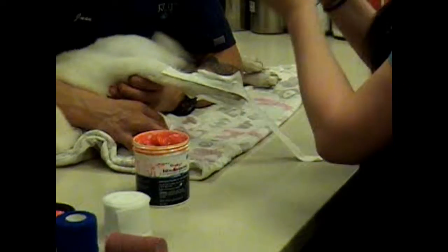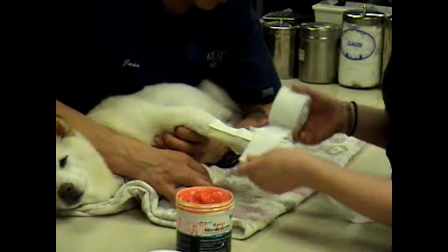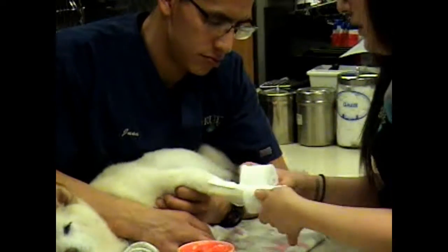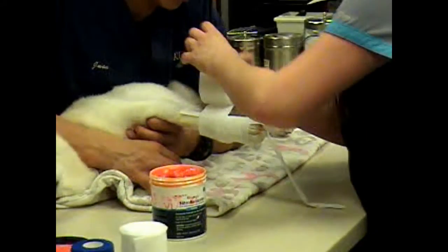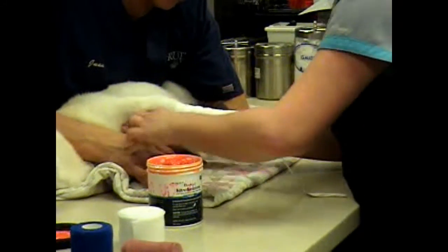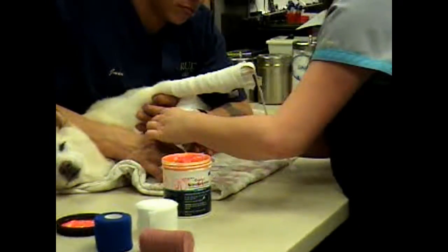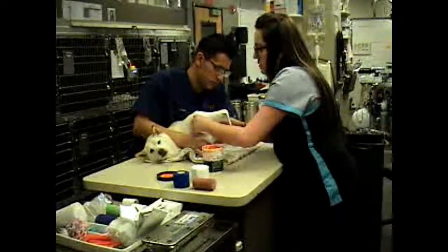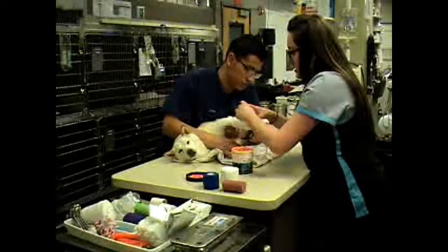We've got some cotton here that will just start all the way at the bottom, just gently rolling up the limb itself. We're just kind of placing this about halfway — each roll up is just about halfway against the last layer that we did.